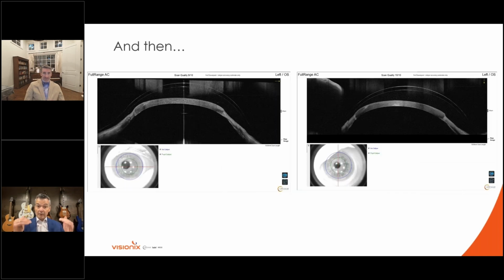So Jeff, you'll sometimes even then tilt where you're actually measuring depending on where those major meridians are, correct? There are some times that I will take not just those 6 images that I showed you, but we will take 4 more that are in the major meridians if those major meridians are not at 3 and 9 and 6 and 12 or close to it. Because we want to find where the flattest part of the haptic is and where the steepest part of the haptic is. And those are really what we're interested in.